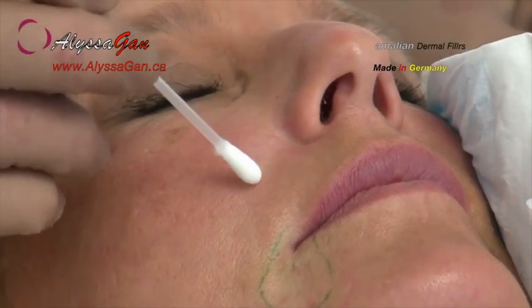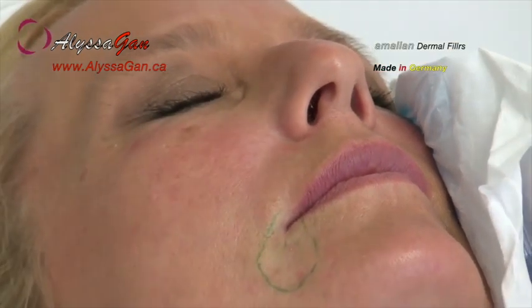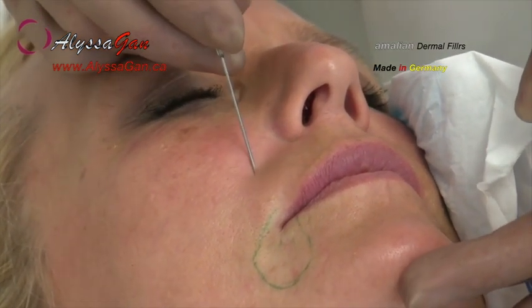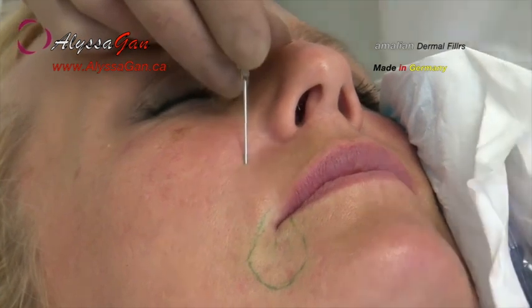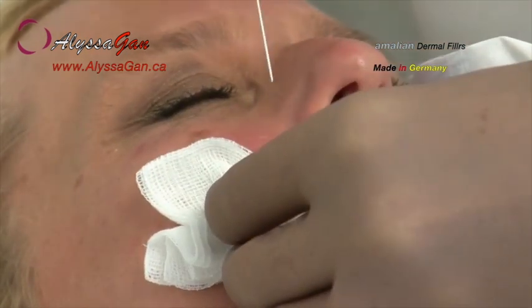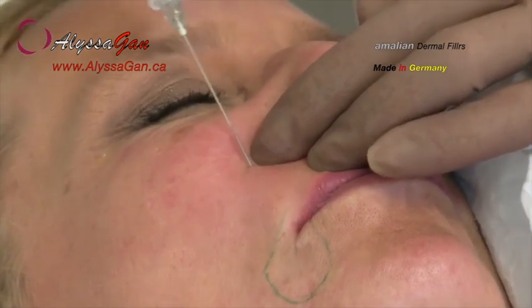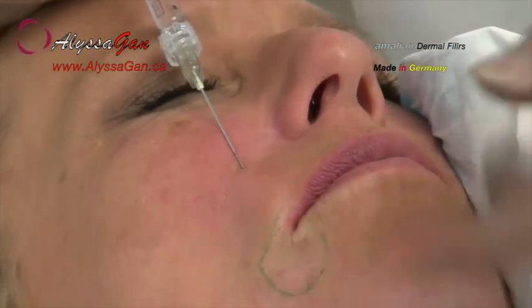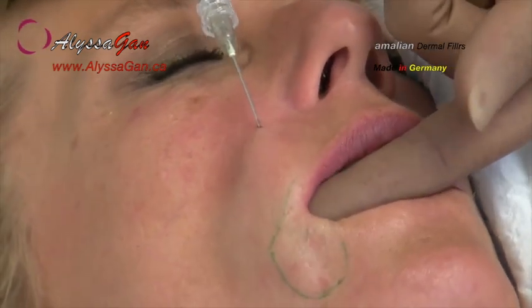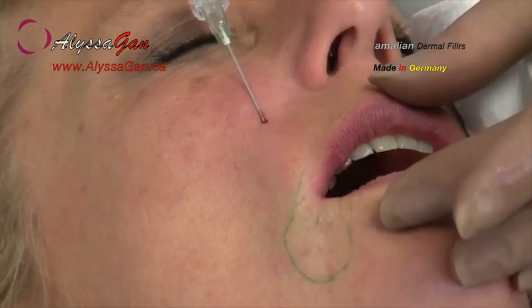The physician is positioned above the patient and directs the needle from a point of insertion above the corner of the mouth to the treatment site. After the now already familiar preliminary preparation, the injection cannula is inserted and brought to its starting point. The exact position of the needle can be identified very well by palpation from within the oral cavity. If the position of the needle tip is correct, the injection is slowly started.